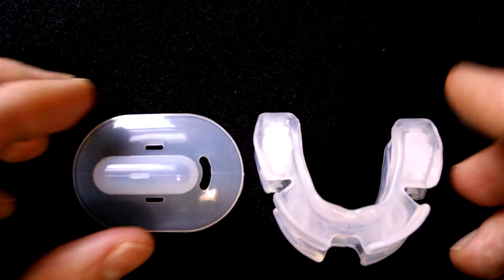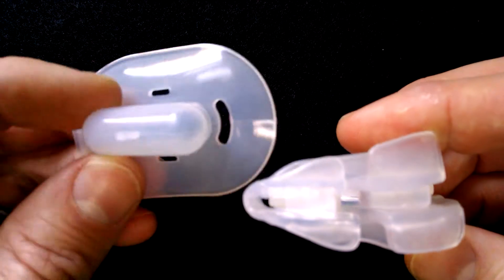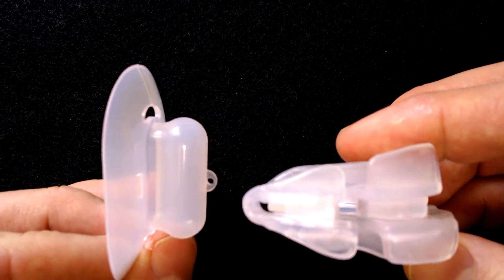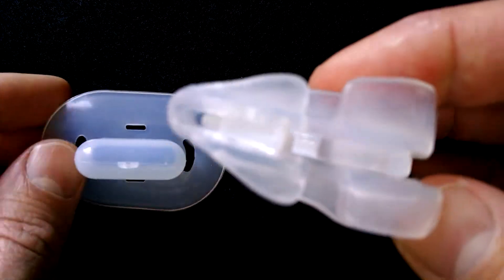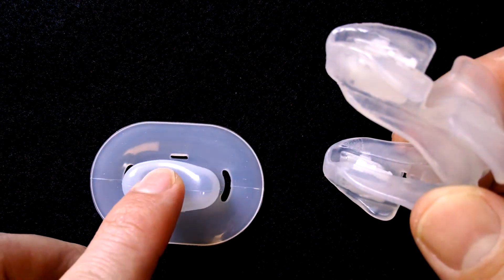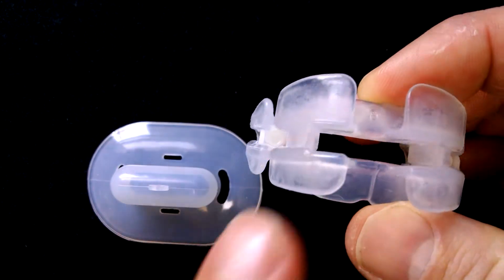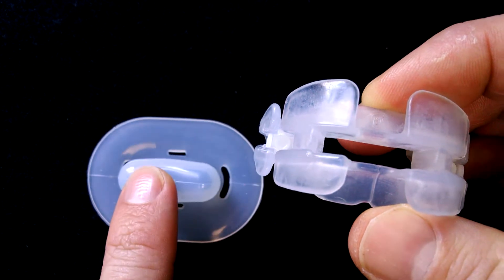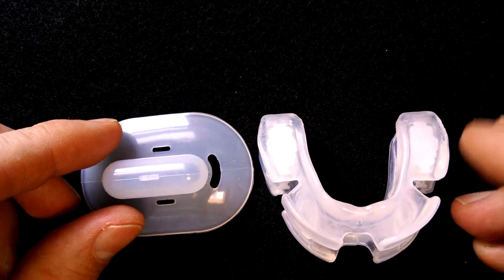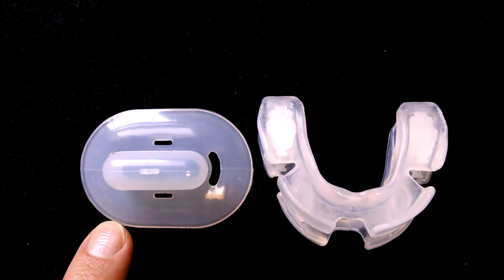In a side-by-side comparison: the VitalSleep is a mandibular advancement device that holds the jaw forward, while the Pacifier is a tongue-stabilizing device that holds the tongue forward. The VitalSleep is adjustable, while the Pacifier is not. With the VitalSleep you can breathe through your mouth, which is an important feature — the Pacifier does not have that ability. Price-wise, you're looking at about $60 for the VitalSleep and about $20 for the Pacifier, so quite a bit of a difference there.